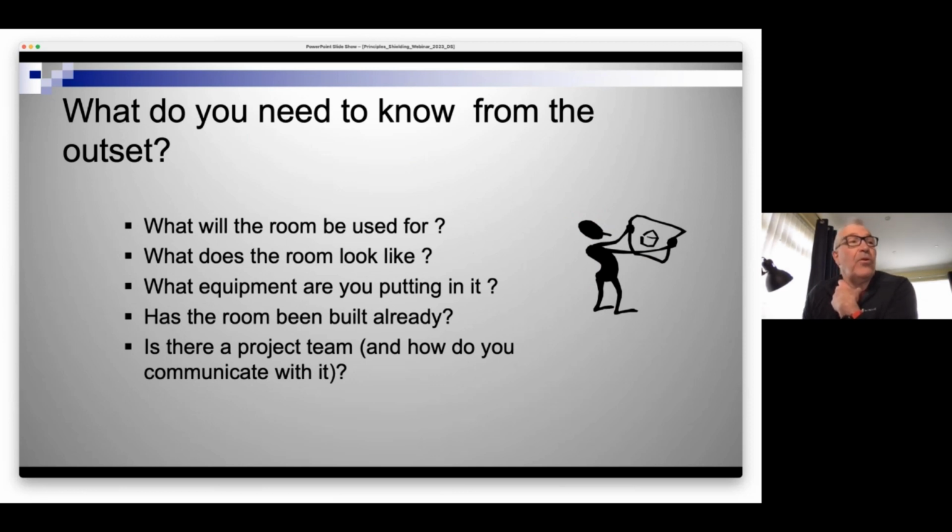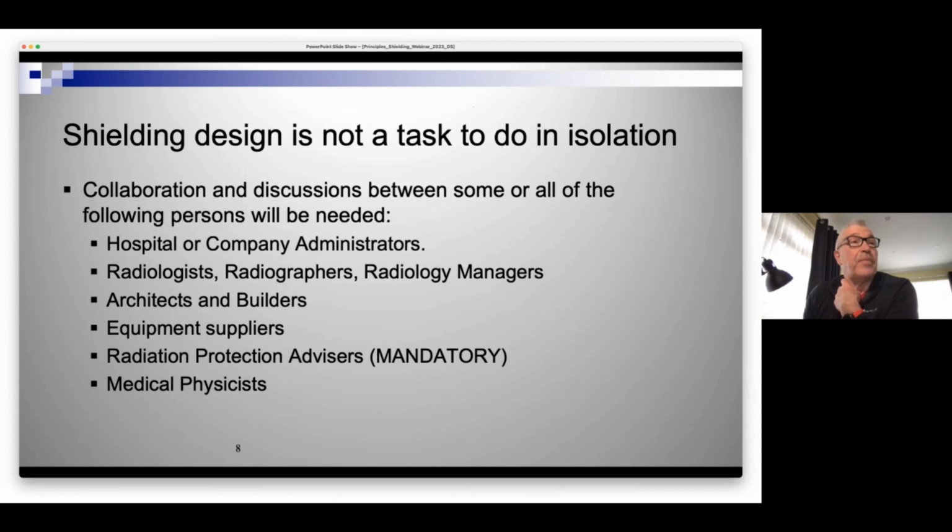Before you even think about what you're going to do, you need to know what the room's going to be used for, what does the room look like, has someone actually built it already and is asking you to comment on it, and what equipment you're putting in. And most importantly, is there a project team? And if not, how are you going to put it together? And if so, how are you going to communicate with it?